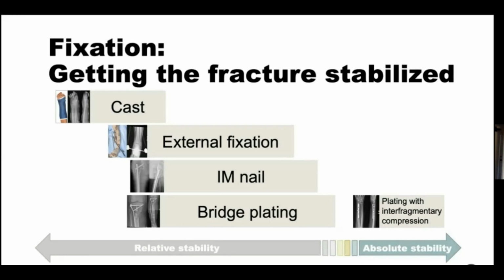And there's definitely things that you can do to narrow that window, to provide more or less relative stability, depending on how you place the pins in external fixation, or what nail or bridge plate construct you use. So those things are under the control of the surgeon. These are things that we think about.